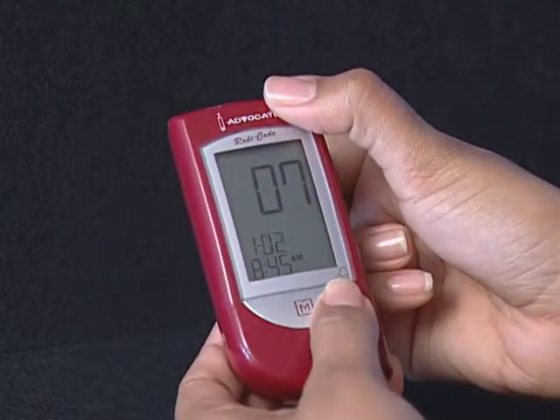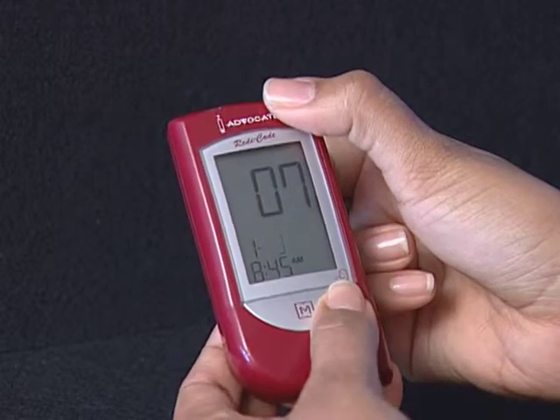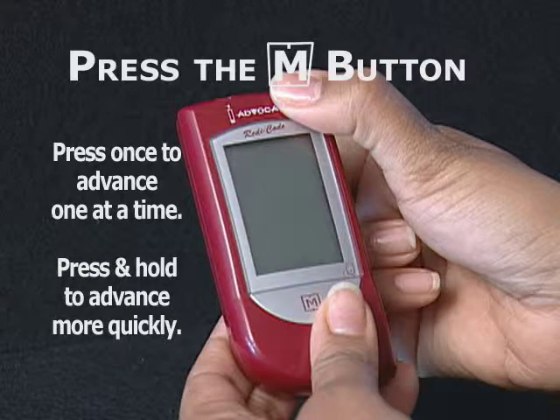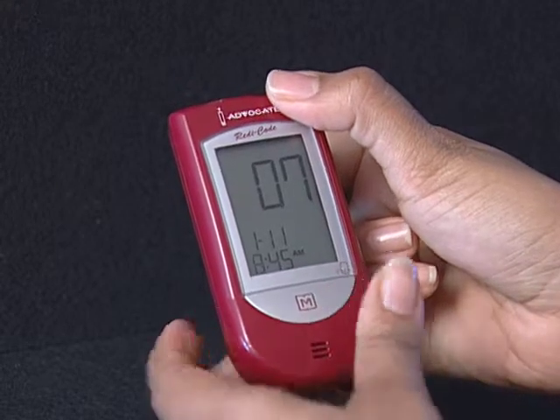Step 3: Set the day. Press and release the M button until the correct day appears. To move faster, hold the M button down. With the correct day on display, press the Set button and then the hour segment flashes.